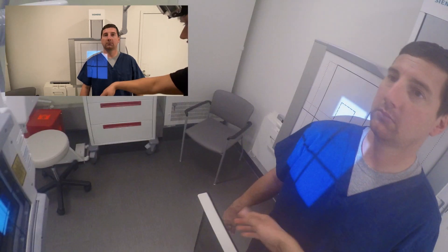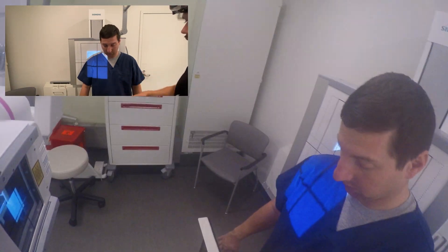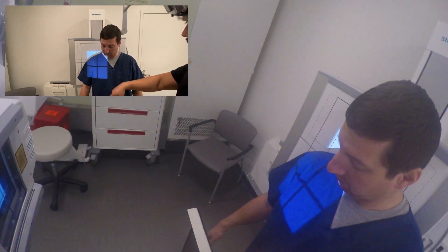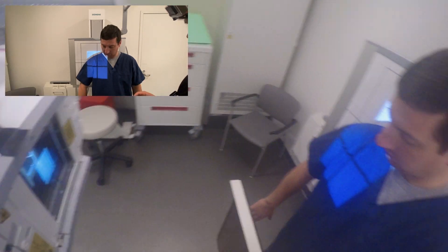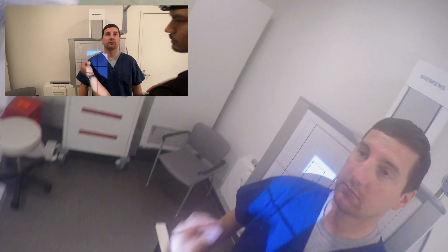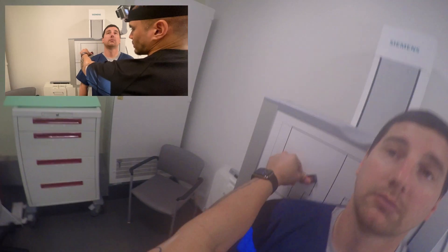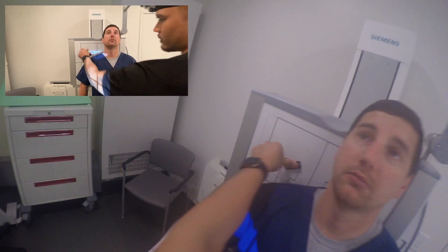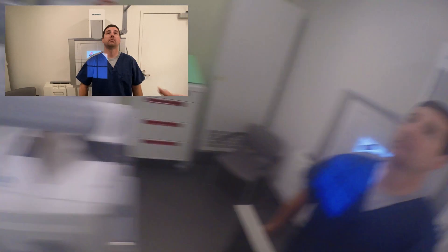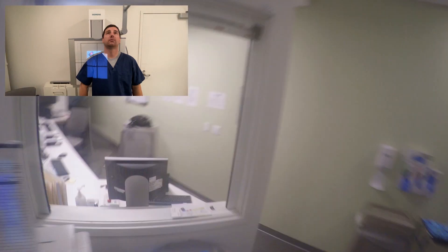So go ahead and rotate your palm backwards. There you go. I'm going to rotate your palm forward, okay? I'll tell you to rotate your palm forward. Go ahead and rotate it backwards for now. Just like so. This is a method I developed over time to be more efficient with my exam when it gets busy. I demonstrate to my patient what I need him to do for the internal and external rotation all at once, instead of before the internal and then again before the external — also saving me a trip back and forth.